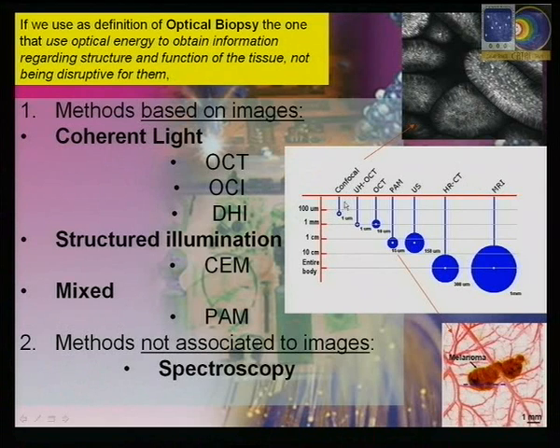The interesting thing is that the more lateral resolution you have, the less penetration you have in the technology.